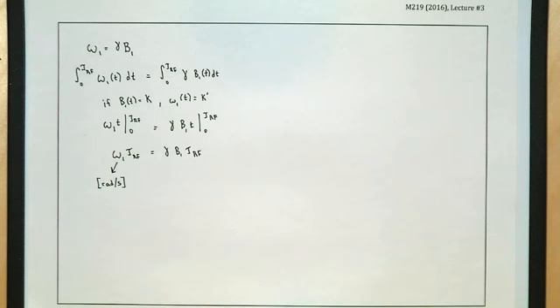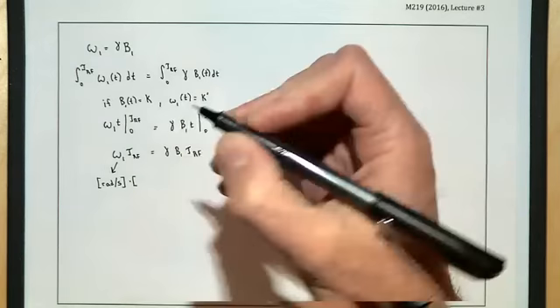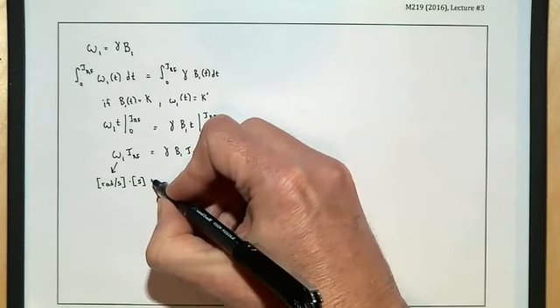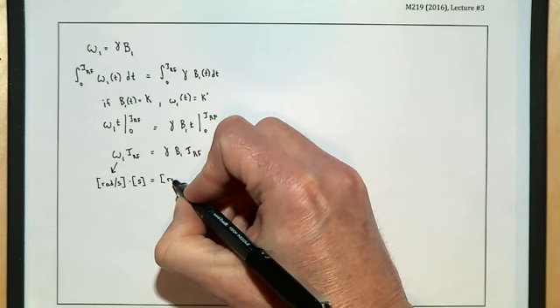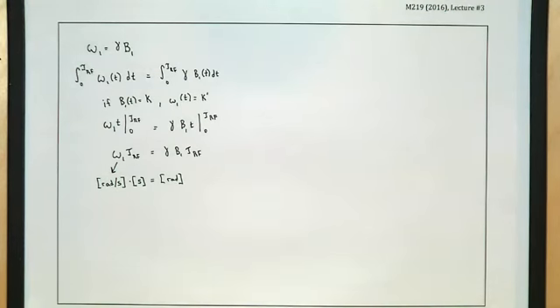We typically think in terms of radians, but we don't naturally think in terms of radians, so oftentimes I'll talk in megahertz because that means more to me. But when you work things out mathematically, you've got to keep track of factors of 2 pi if you want to work in terms of frequency. And then what are our units for time? They're just going to be something like seconds. So the product of those two things is just radians. Frequency times duration just gives you some radians.